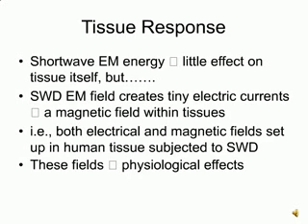The actual passage of electromagnetic energy through the body has little effect on the tissues themselves. However, the electrical currents and magnetic fields created, both of which are set up in the tissues, will create physiological changes due to their effects on charged particles.